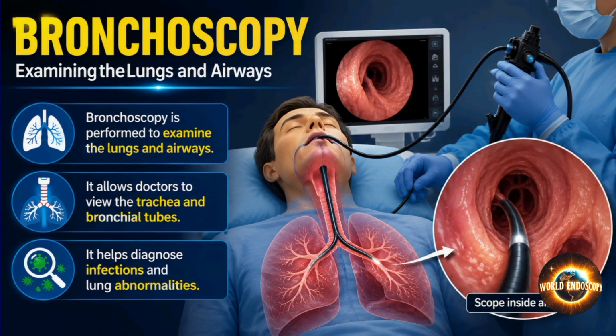Bronchoscopy is performed to examine the lungs and airways. It allows doctors to view the trachea and bronchial tubes. It helps diagnose infections and lung abnormalities.